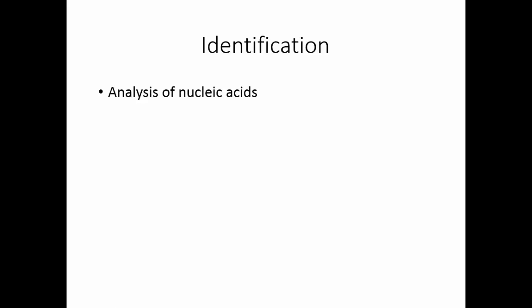Again, a technique not typically done in the clinical laboratory is analyzing the nucleic acids, actually looking at the DNA or the RNA. Initially, a very popular test was to check the guanine and cytosine content. That would help identify organisms, roughly putting them into one group or another.